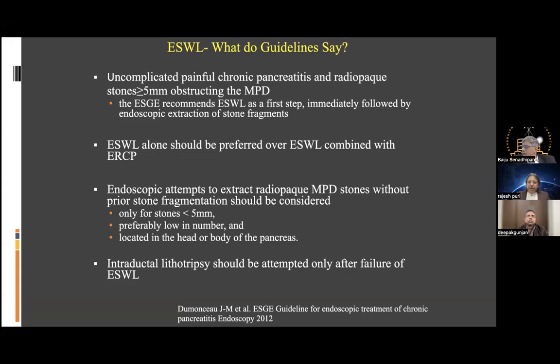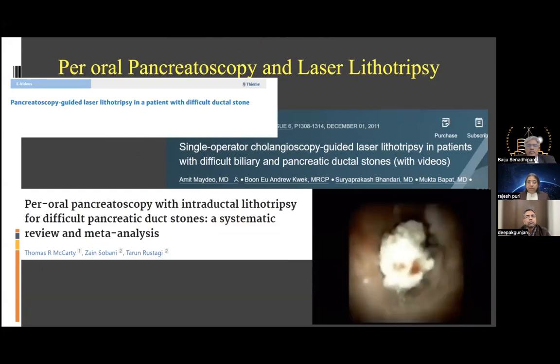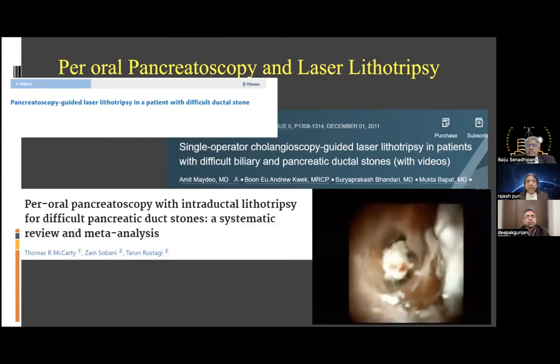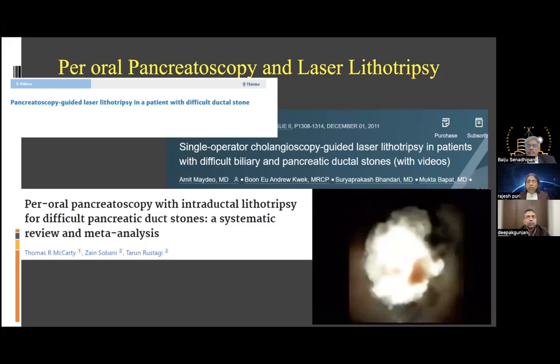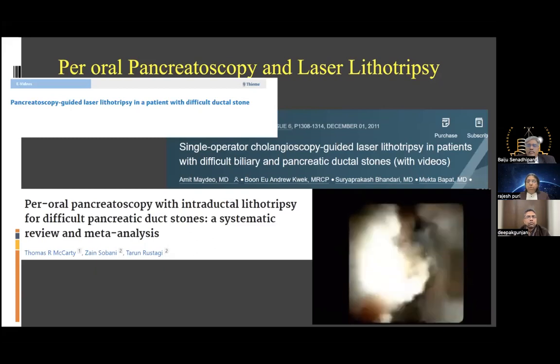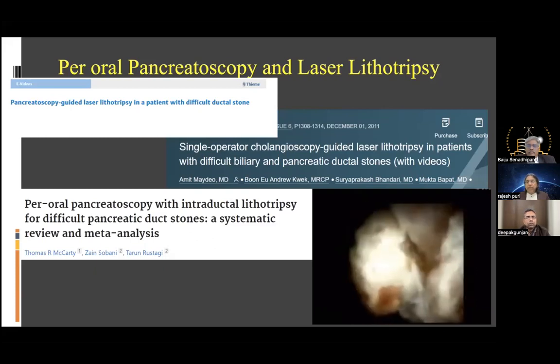In day-to-day practice, I don't try the pancreatic lithotripsy. But pancreatoscopy is available. Case reports and case series are there. You can see the stone in the neck of the pancreas. You take your EHL probe, blast, and you can fragment them into small pieces.